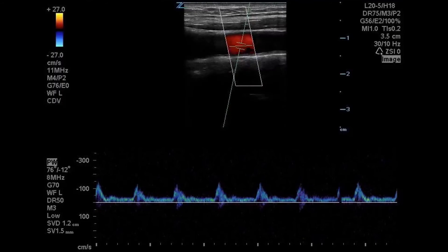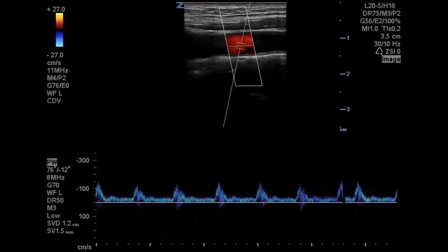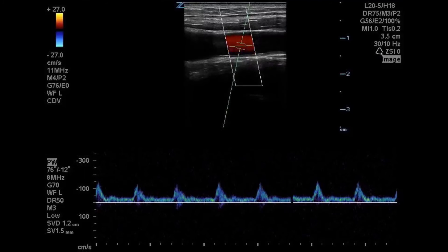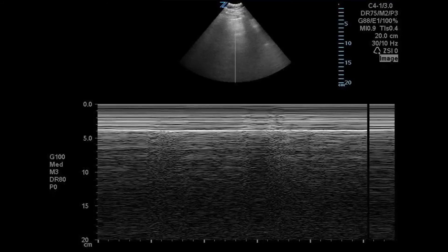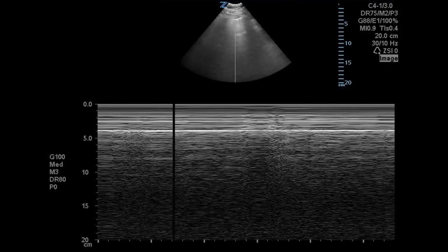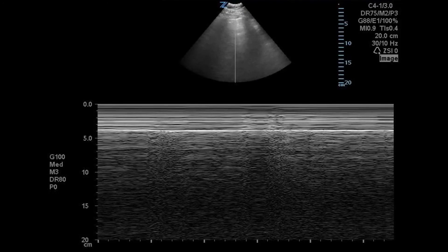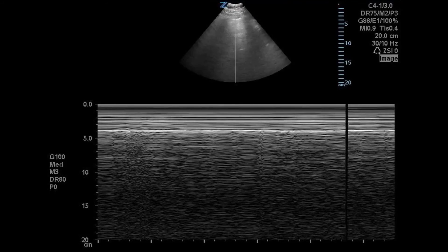You can see triplex imaging where we have our real-time B mode image, our color Doppler image, and we're obtaining a spectral tracing. If you press the store key while obtaining your tracing, it will record a clip of the tracing. M mode is activated by pressing the M key, which creates your M mode trace. Unlike other systems such as the Sonosite, you can have real-time B mode imaging and M mode tracing at the same time.